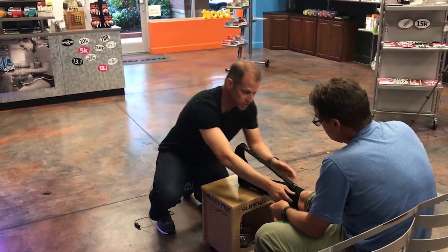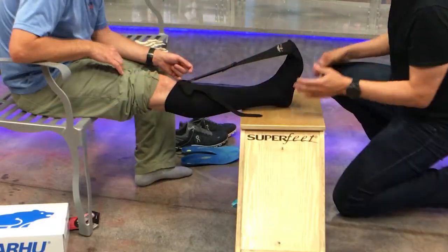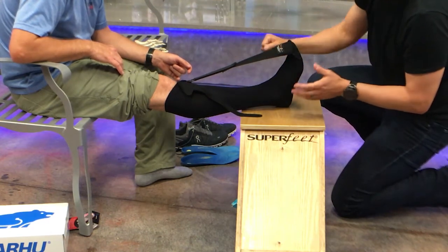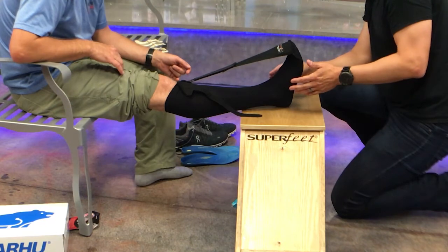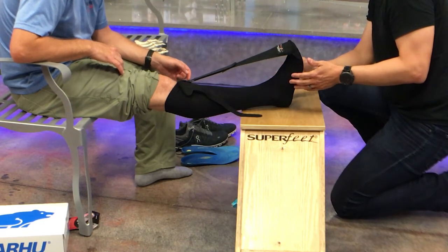And if you've got it on properly, you can actually undo this upper strap, and the sock will still hold its position. A lot of people get concerned when they wear this — they don't think they could tolerate it pulling on their toes all night long. Actually, in the research study that was done on the sock, which was the largest night splint study ever conducted, all of the patients were able to tolerate wearing it at night.